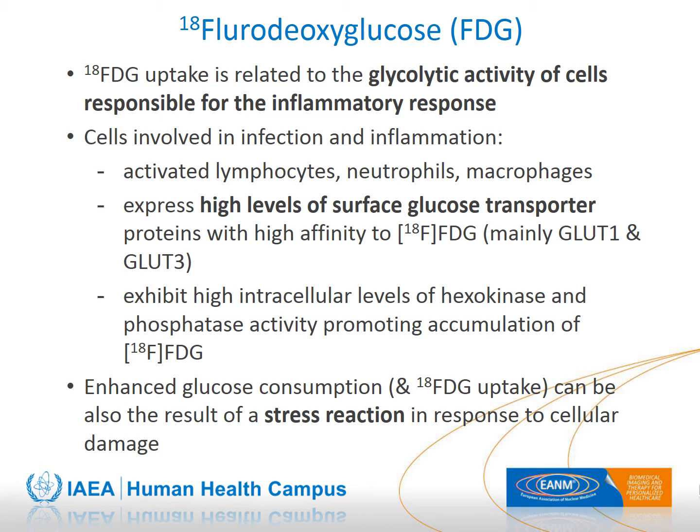We now move on to fluorodeoxyglucose, or the holy grail of PET imaging. FDG uptake is primarily used for cancer imaging, but it was often seen that there was uptake in non-cancerous cells, particularly those involved in an inflammatory or an infectious reaction.